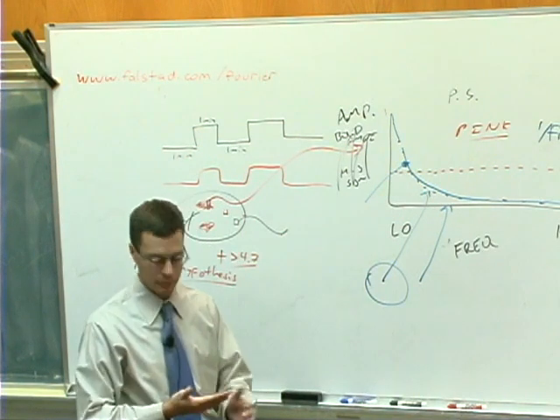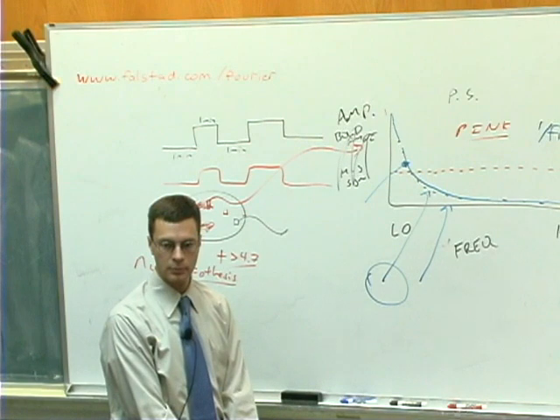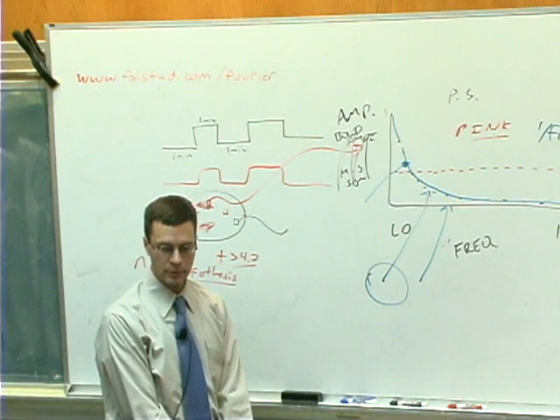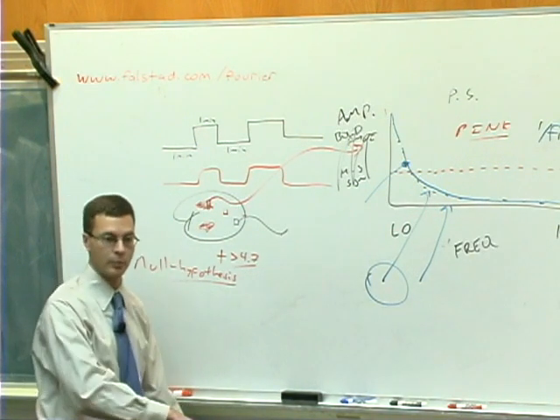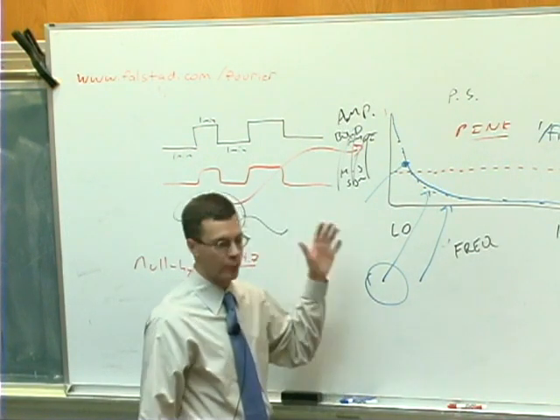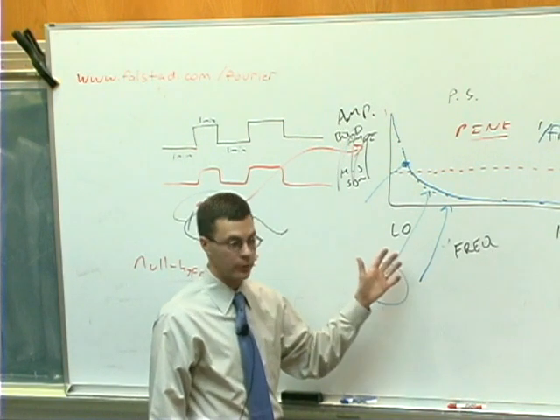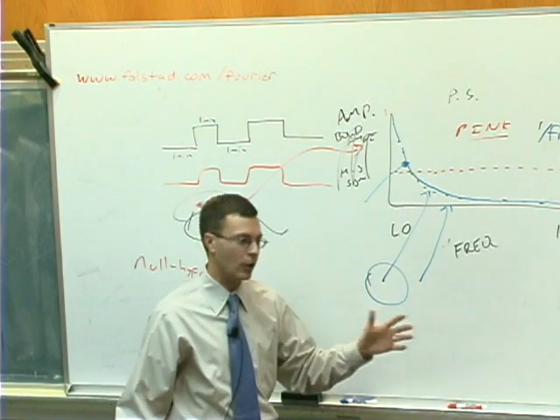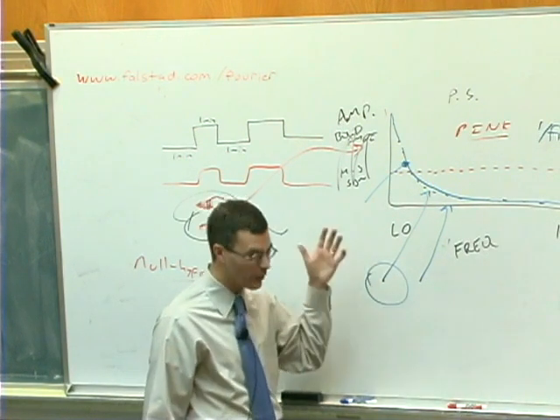It's going to be scattered all over the whole brain, not like that, only flat. So is it the case that some areas of the brain have more 1 over f noise than other areas? Yes. And in fact, let me start by saying this is a very irritating property of BOLD fMRI data. It is irritating because it means all the traditional statistics that one might use to analyze data are no good. It also produces all sorts of complications for designing fMRI experiments, which we'll talk about in just a moment.